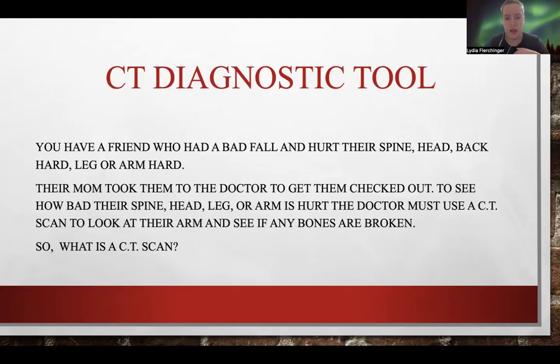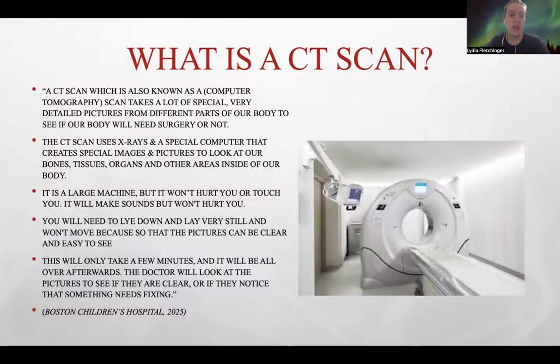So what's a CT scan? A CT scan is also known as computed tomography. It scans and takes a lot of special and very detailed pictures from different parts of your body, and also to see if your body will need surgery or not.